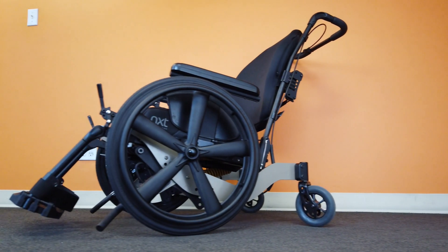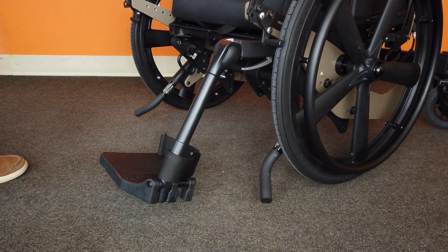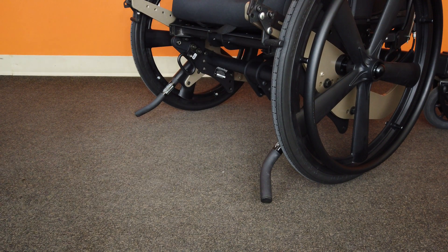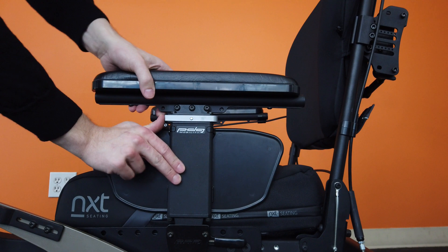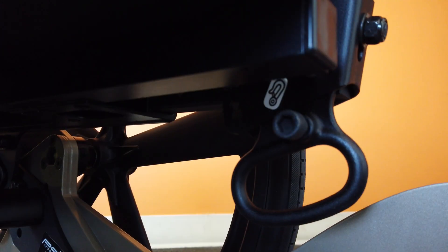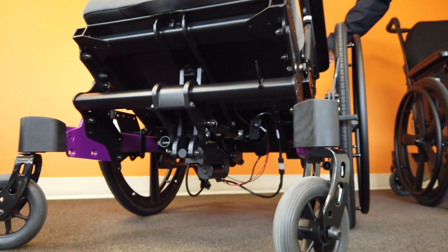Despite the departure from the standard wheelchair layout, the Bentley LTR is still compatible with most PDG accessories, including the easy-out front rigging systems, armrests, transit tie-downs, O2 tank and IV pole holders, and even the PDG power tilt system.